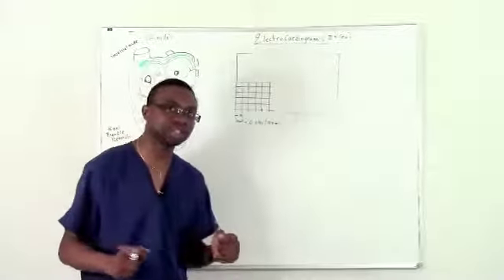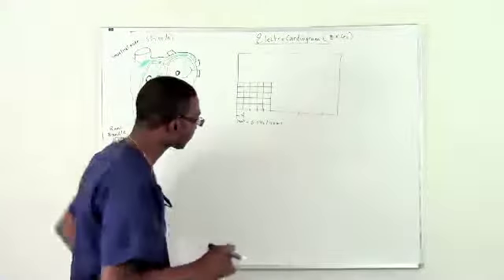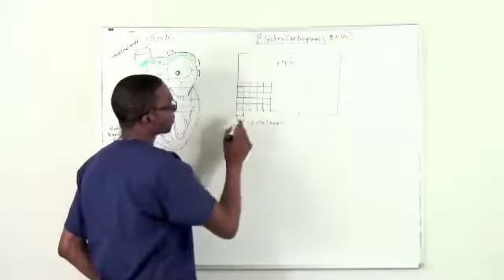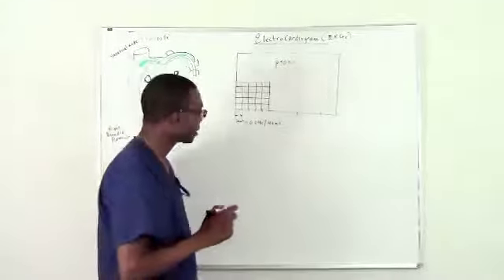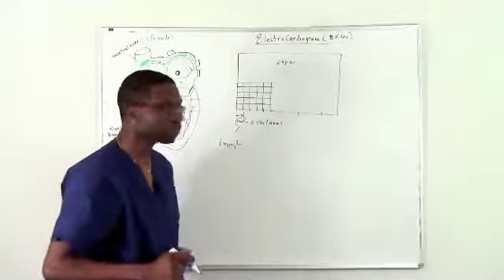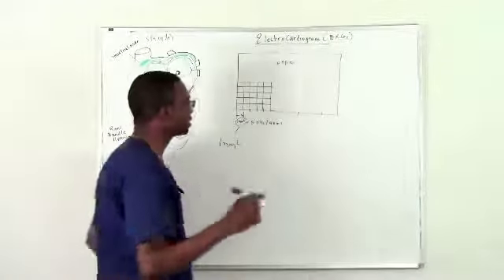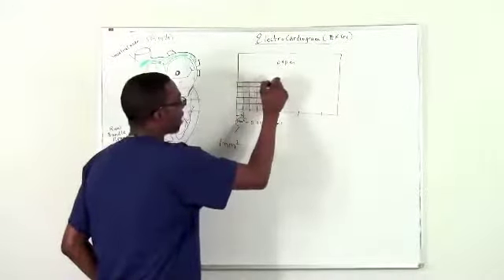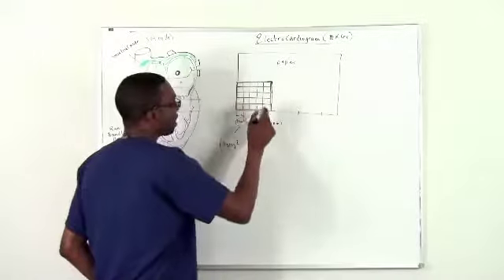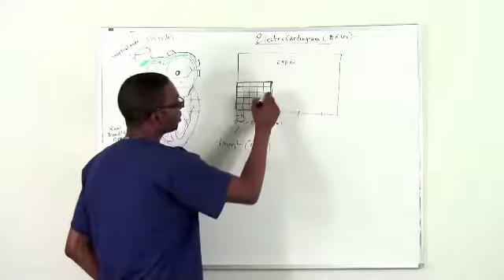Have you ever seen a paper of EKGs? It actually has a couple of boxes. This is just a rough sample paper that I drew on the board. There are small boxes on the EKG, and each box is 1 millimeter square. Then you could count 1, 2, 3, 4, 5. There are 5 small boxes, which form a thick box. And those boxes are 5 millimeters square because there are 5 little squares. See that? 1, 2, 3, 4, 5.